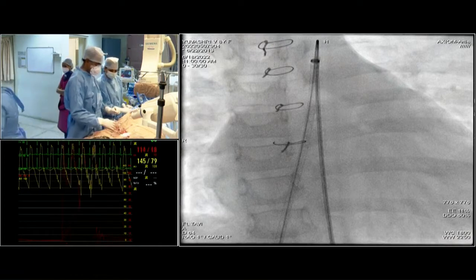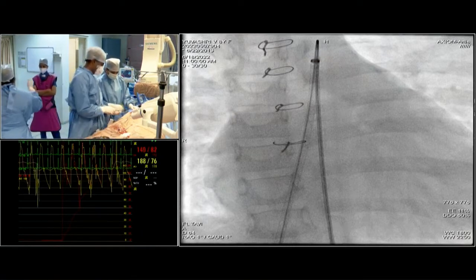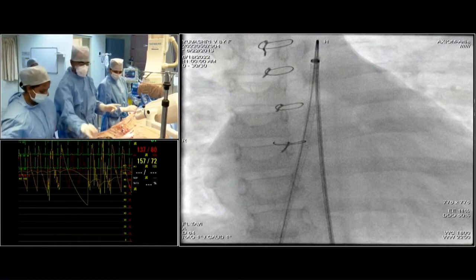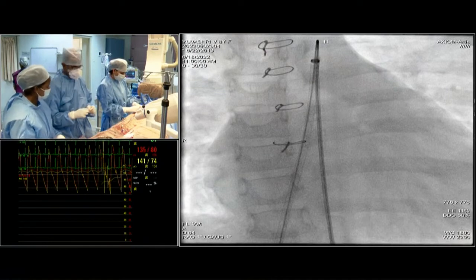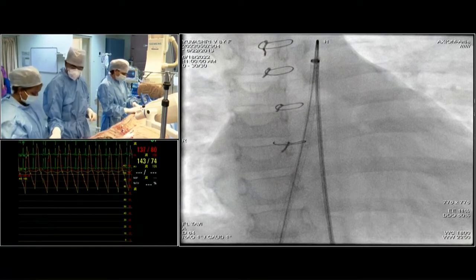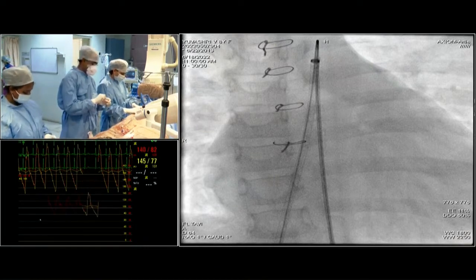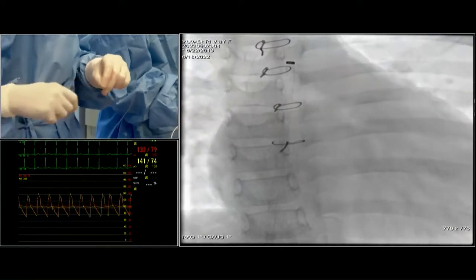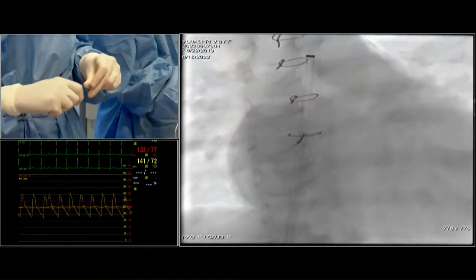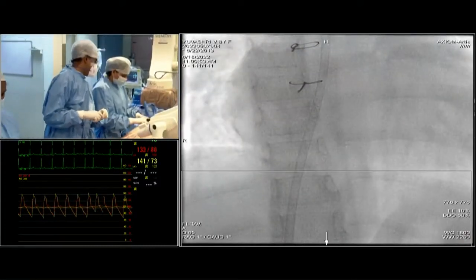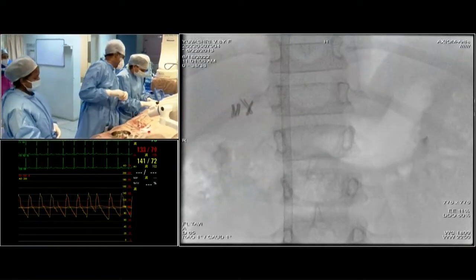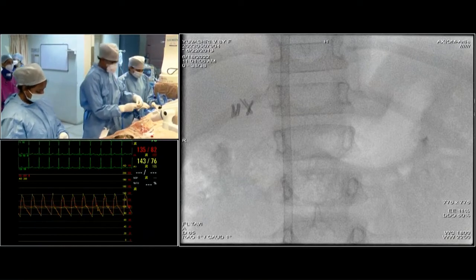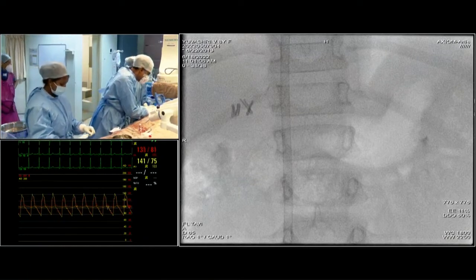I'm flushing the lines. The pigtail catheter helps identify the anatomical location of the non-coronary cusp — I will place it at the lowest point of the NCC. We should limit contrast use — in very sick patients with renal failure, creatinine around 3-4, you must minimize contrast. Most steps can be done using TEE, echocardiogram, or anatomical landmarks alone.